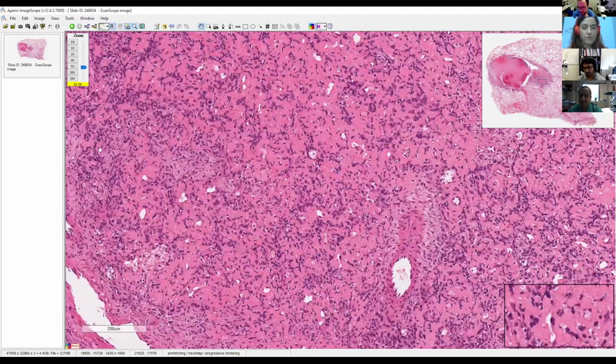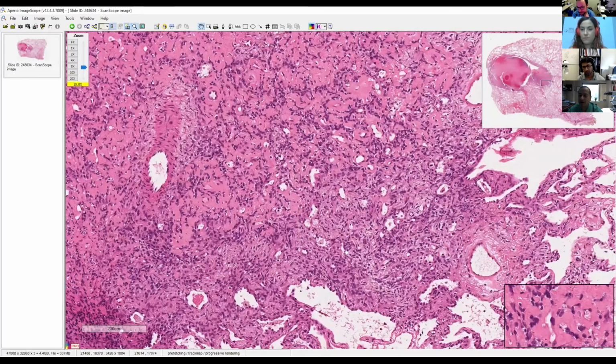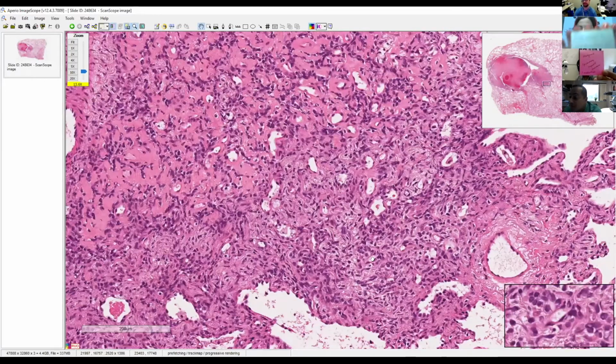Makes sense. All right, guys, do you want to go ahead and make your guess? I say malignant, sarcoma, metastatic, pulmonary myxoid sarcoma, because I was imagining a big old dilated airway kind of thing. Those are my thoughts. Okay, and Matt has spindle cell neoplasm, question metastatic. Yes. And Irene has stromal sarcoma. Yeah, metastasis. What was that? Stromal sarcoma, GYN, endometrial sarcoma metastasis.